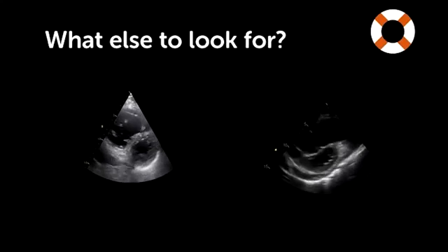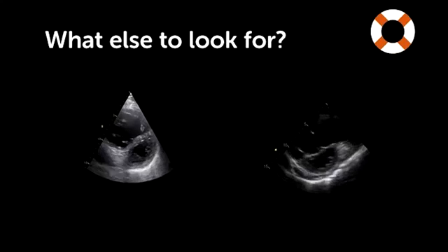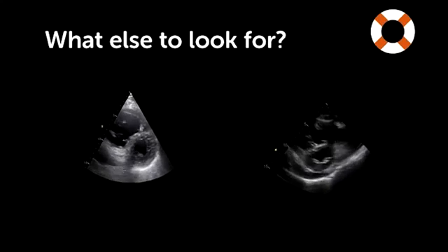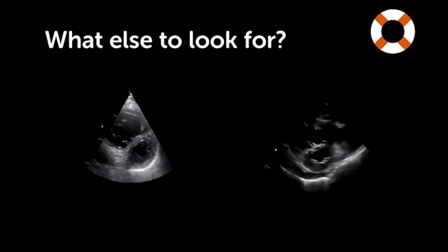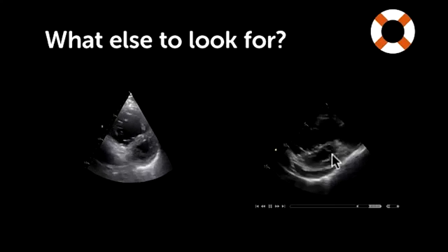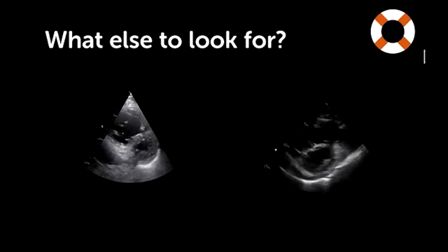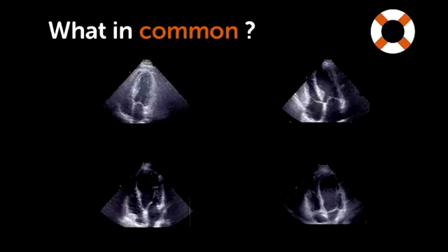Septal flattening is the result of right ventricular pressure overload, which presses the septum towards the left ventricle during systole, or right ventricular volume overload. Septal flattening can be subtle, moderate, or very severe, as you would see in this example here on the right. The left ventricle is severely distorted. 6 more examples to go.